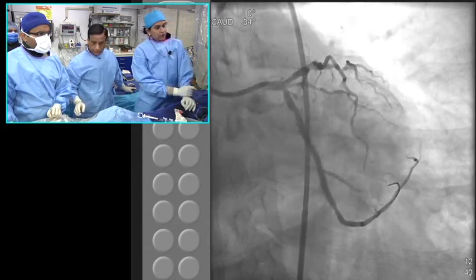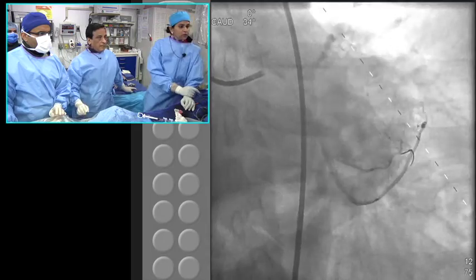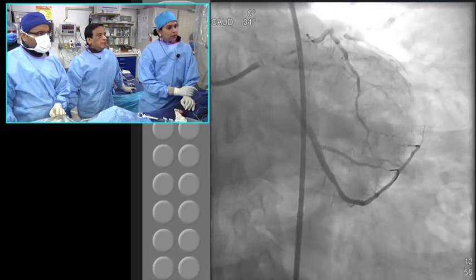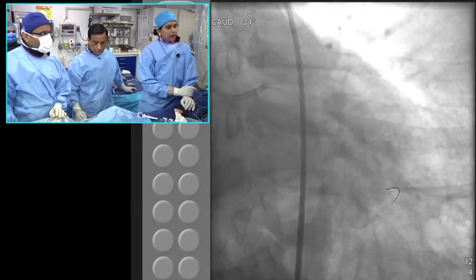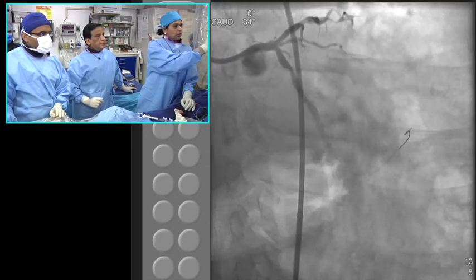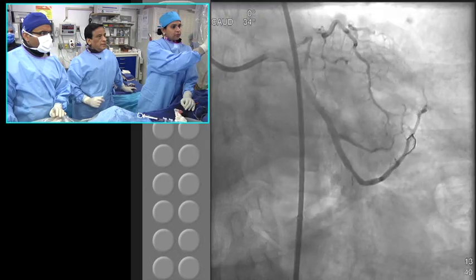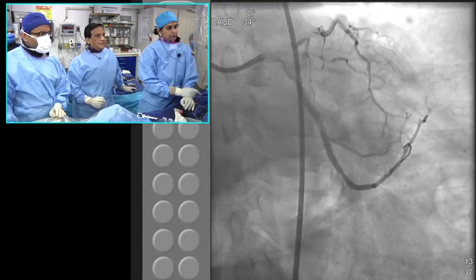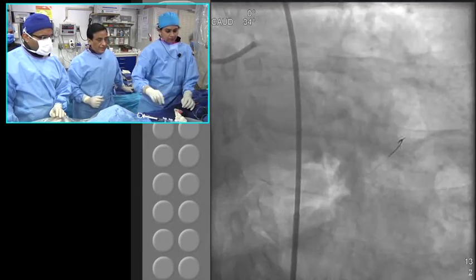This was a slow flow with some EKG changes. So we lost that small OM2, I would say, and then the OM3. But just with vasodilators, everything got better. But the small OM is actually gone now. But this was just with the vasodilator. Maybe give a little 2B3A bolus, it will come back even faster. Liquid, I call it liquid stent.